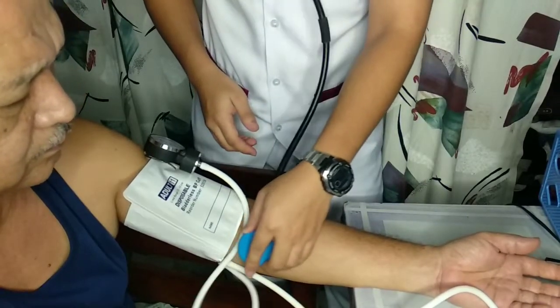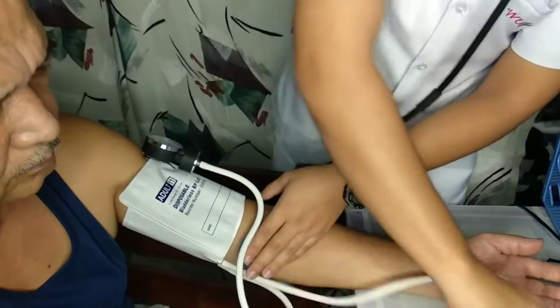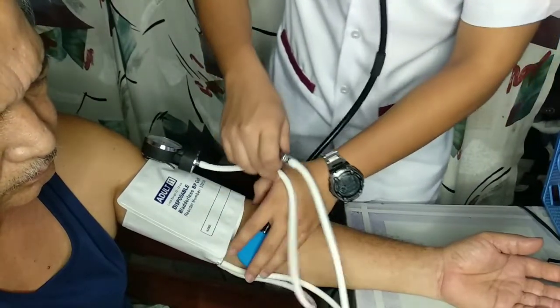You need to add 20 to 30 mmHg. So inflating.